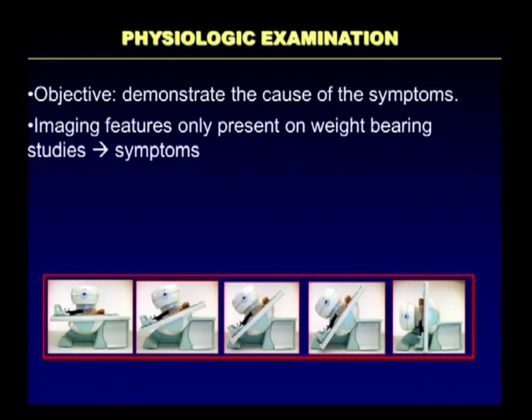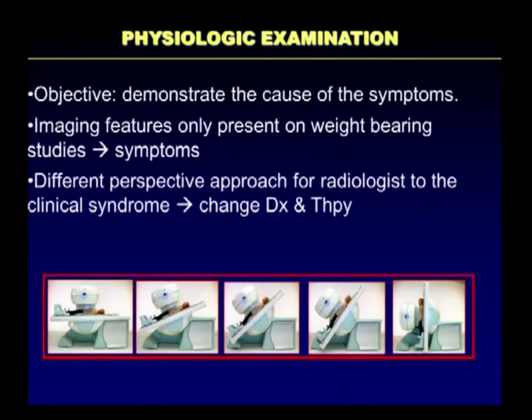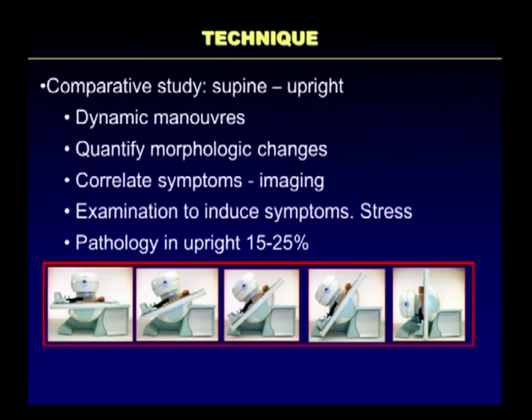Certain features might not be present if we analyze an examination in a static position. The morphologic changes that we might find using a loading examination might change the diagnosis, but more importantly, it might change the therapy, because there is a different imaging picture.